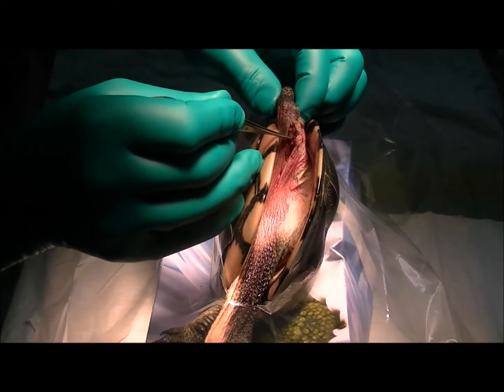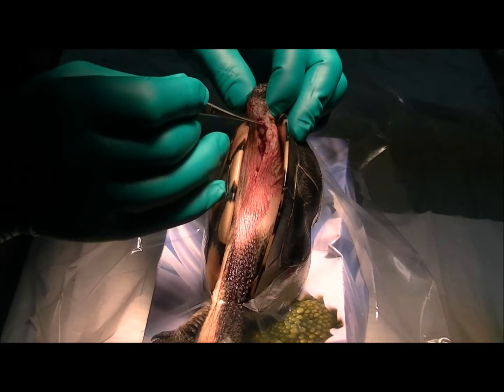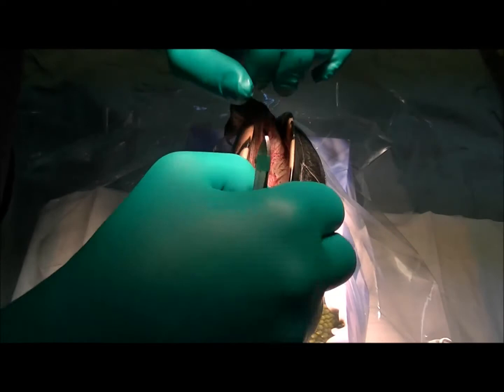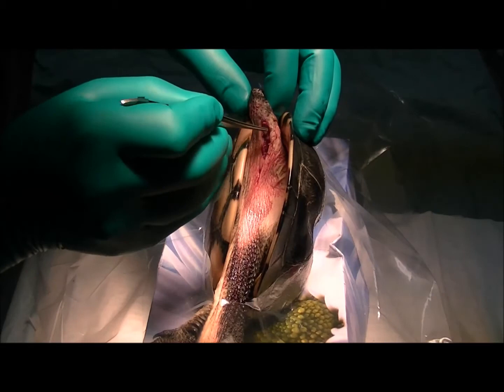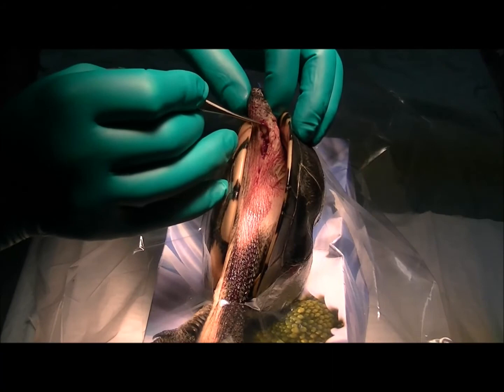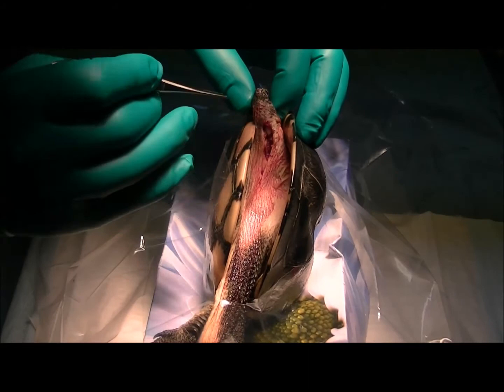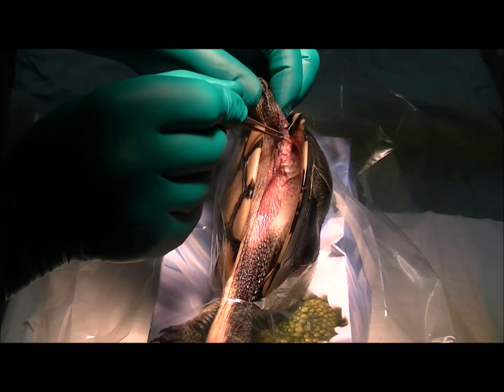We've cut the pin off so it's not sticking out through the leg, and we've got the fracture all lined up. Now I'm going to close the subcutaneous tissues and the skin. I was hoping to get what we call an external fixation on this, because as a tube it has the potential to still rotate around the pin. My plan was to try to place a little wire on either side of the fracture and create a small external scaffold, but the bone is just too small to achieve that. It's pretty stable and we can bandage her up for the next six weeks.